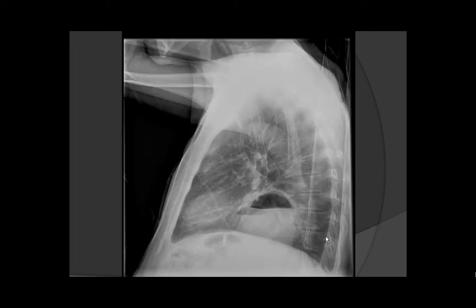In this lateral view, again, it is clearly demonstrated that gastric contents are above the diaphragm and that there is an air-fluid level within the stomach.